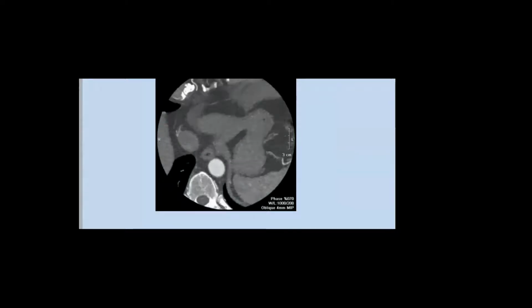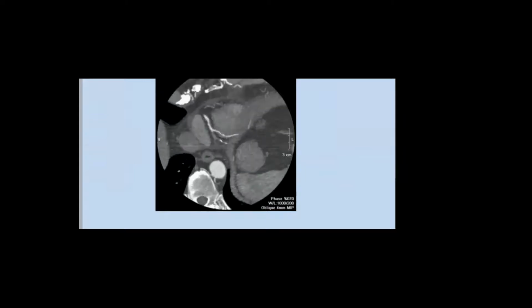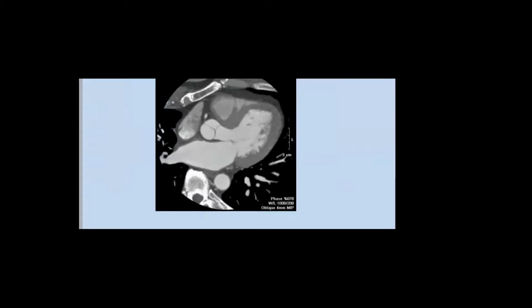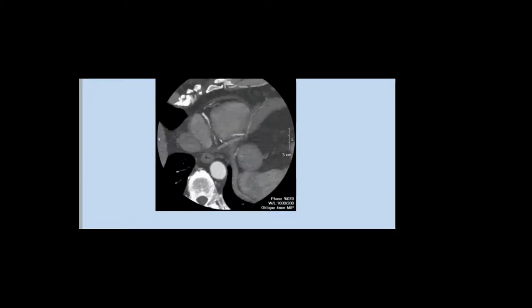Now, this is the cardiac CT, the axial images, which is called the source data. After you finish, that's what you get. Now you can reconstruct this data in different formats, so you can get plenty of display modes. But this is the raw data. And you see the right side is on this side. Imagine that you are seeing the patient from the feet. So the right side is on this side, the left side on this side, right?